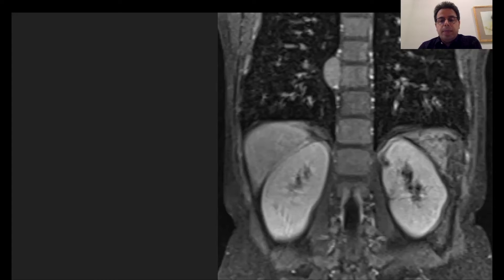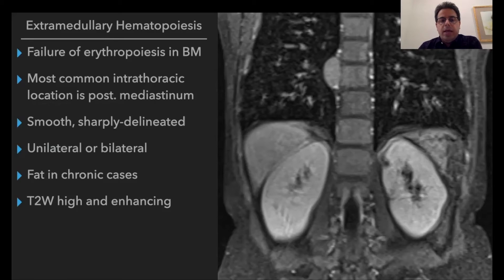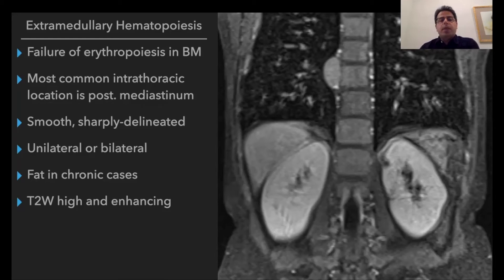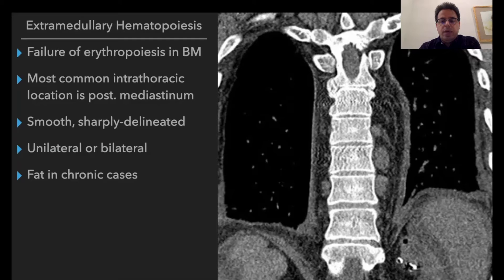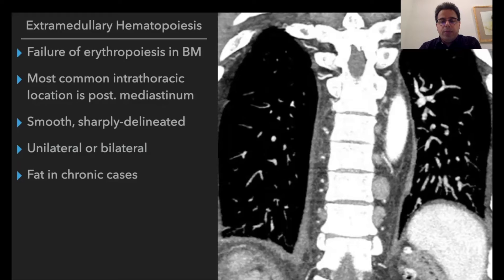On post-contrast MRI, there is significant enhancement within the mass. The location, smooth contour, and enhancement favor extramedullary hematopoiesis, which we see in patients with failure of erythropoiesis. History is very important in making this diagnosis. These lesions can be bilateral, as seen in this case with several significantly enhancing soft tissue lesions on the bilateral aspects of the vertebral bodies.